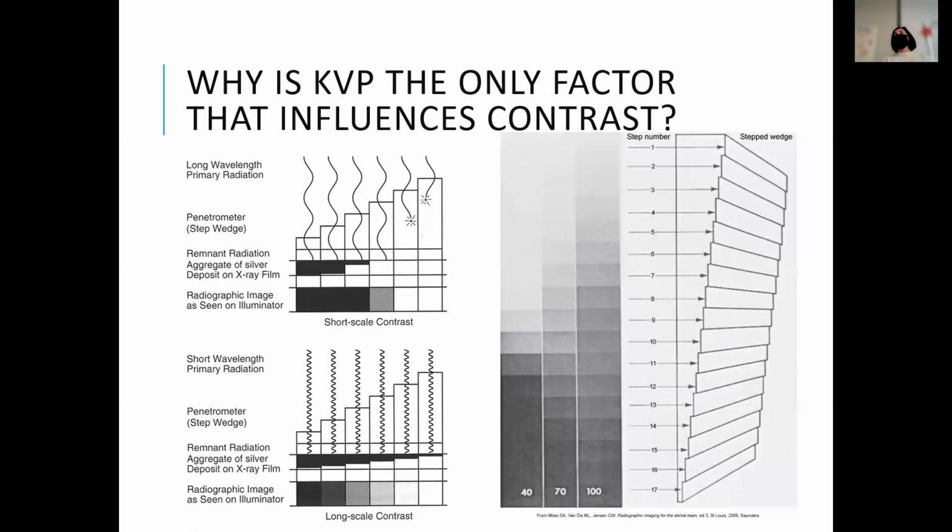If the KVP gets turned up too high, the power gets even higher beyond what we would want. So at 100 KVP, it's just too dark all around. You don't get hardly any light anywhere, because practically all the X-ray photons are getting to your sensor. You see?